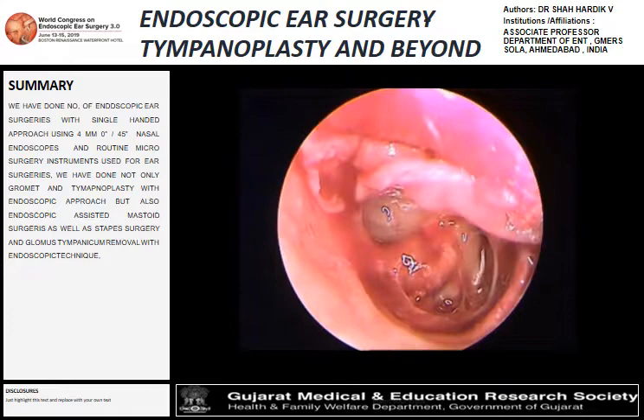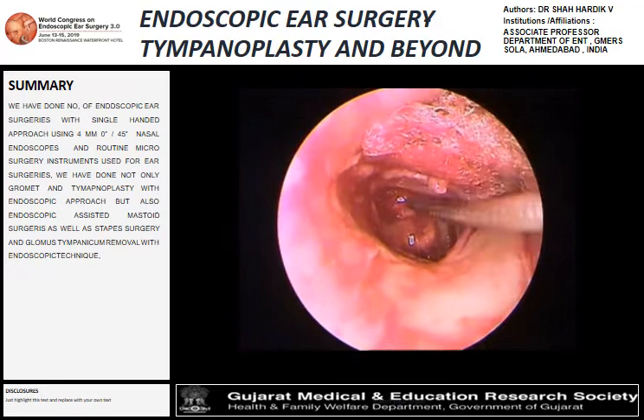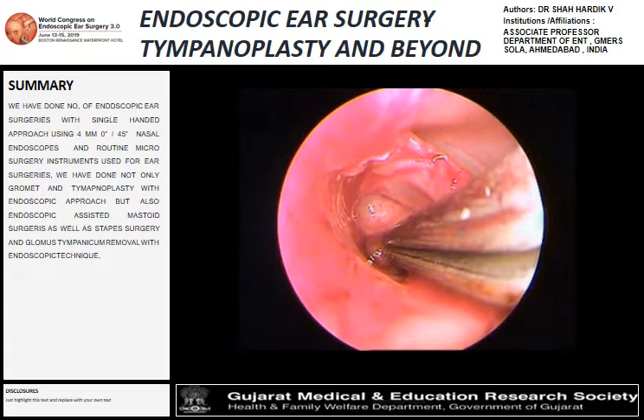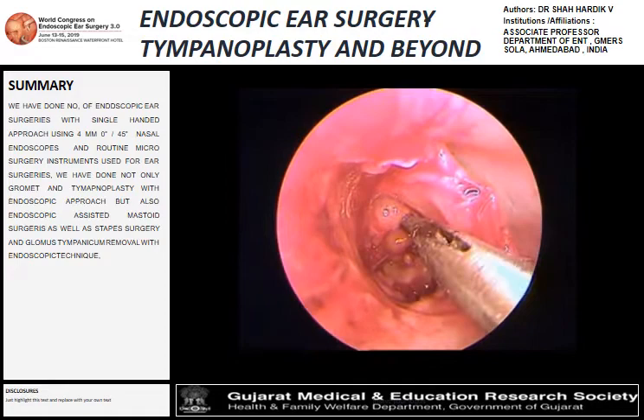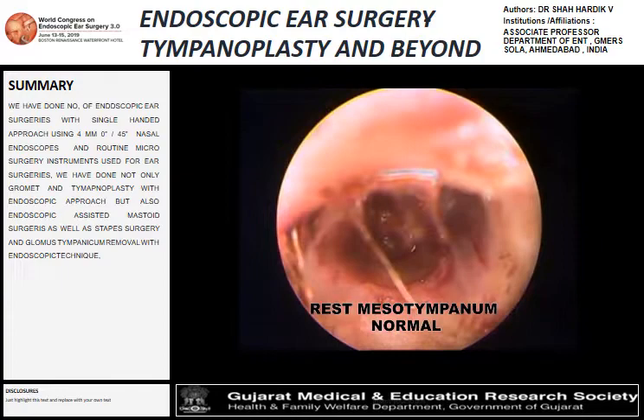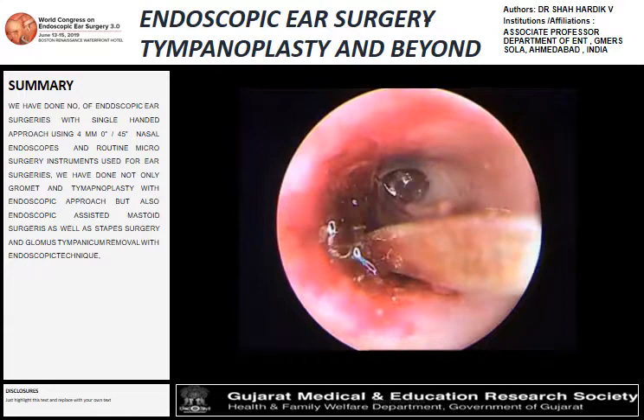In the hypotympanum, that's the elevation and separation of the tumor from the promontory. This step shows the bipolar cauterization of the tumor, then removal of the whole middle ear tumor which was attached to the jugular bulb, with complete clearance and an intact ossicular chain. That's the repositioning of the tympanomeatal flap after surgery — this is how the endoscope helps us achieve results without post-aural or endaural incisions.